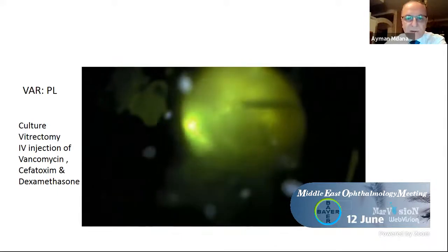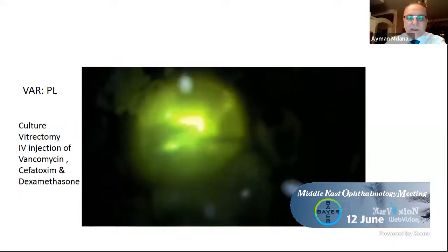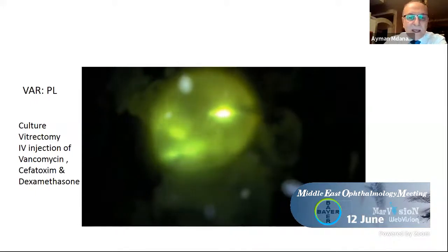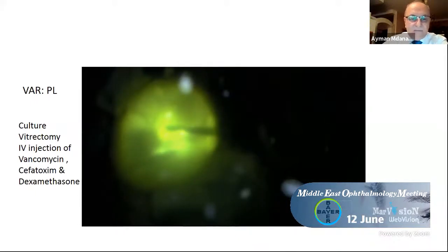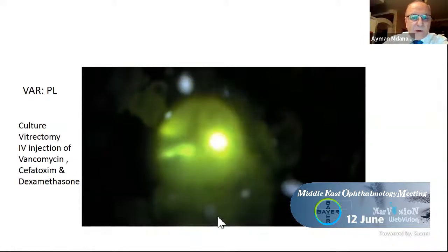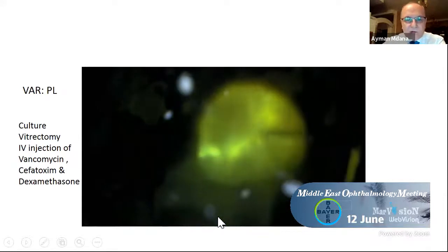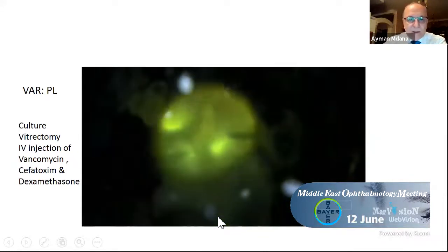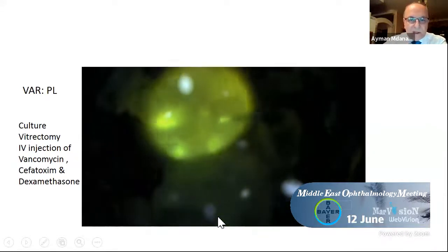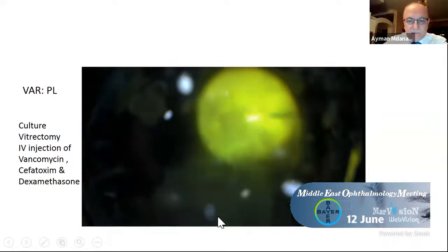Just be patient, remove the vitreous bit by bit until you see the retina, or if you can see the blood vessels, or if you can see any landmark of the retina. This would be your reference, and from here things might become a little bit easier for you.